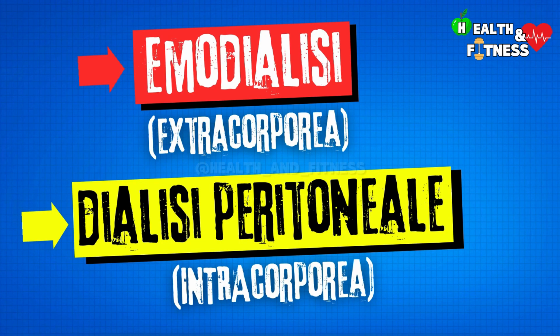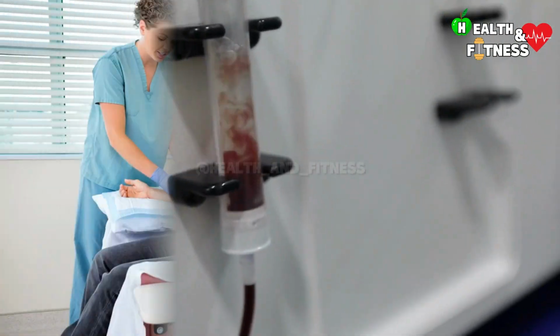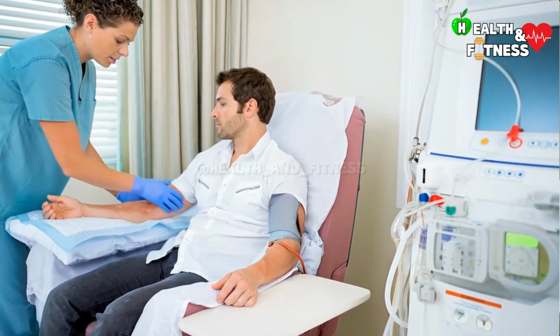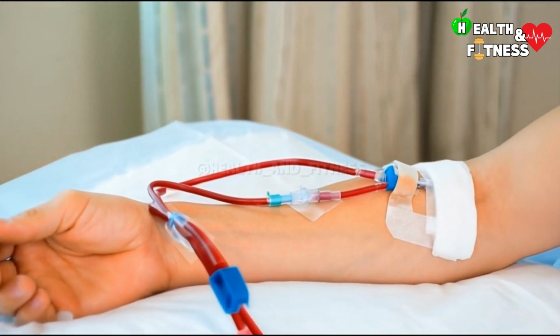Hemodialysis is a medical treatment that filters the blood outside the body using a special machine, commonly known as an artificial kidney. The patient is first seated in a chair or placed on a bed. A vascular access is then created, the point through which the patient's blood can be removed and returned during the hemodialysis session.